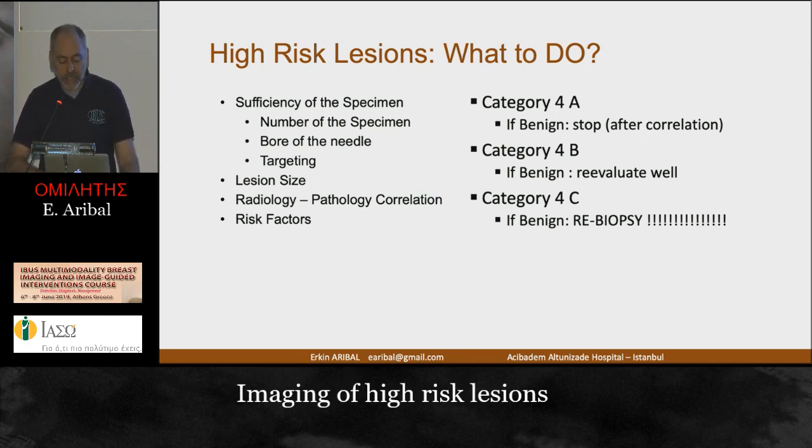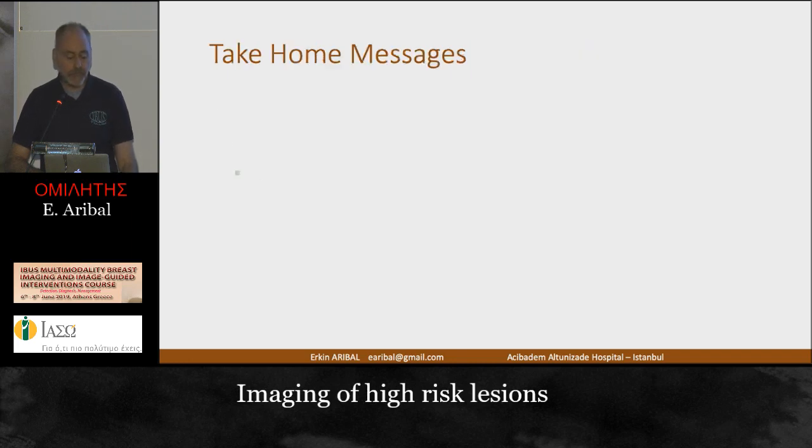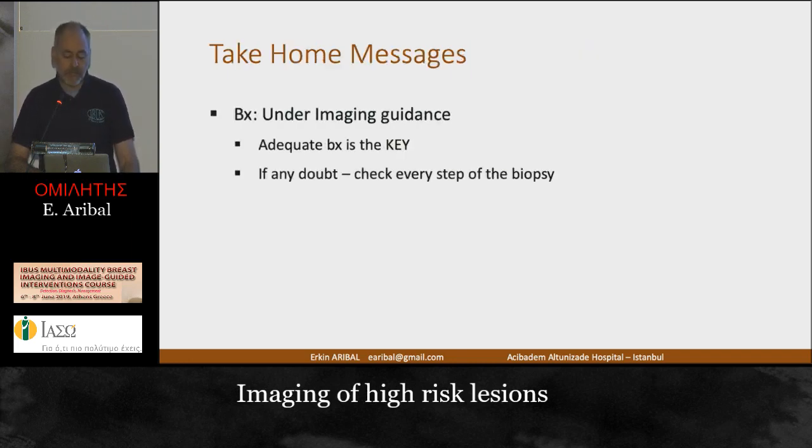Radiology-pathological correlation should be made in a common meeting, and you must also keep an eye on risk factors of the patient. Another take-home message: under imaging guidance, the adequate biopsy is the key, so be sure that your biopsy is adequate by doing the specimen radiogram and also re-imaging of the breast after biopsy.